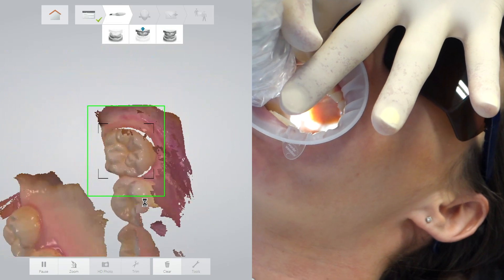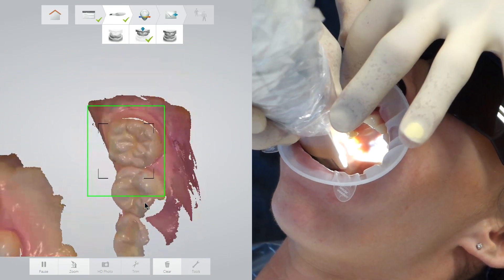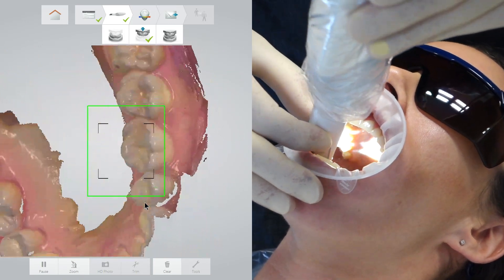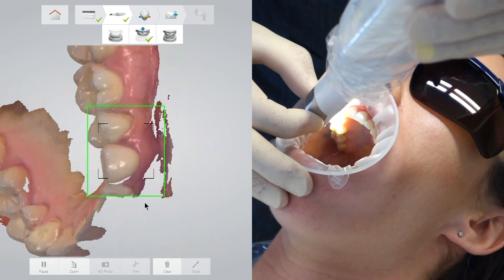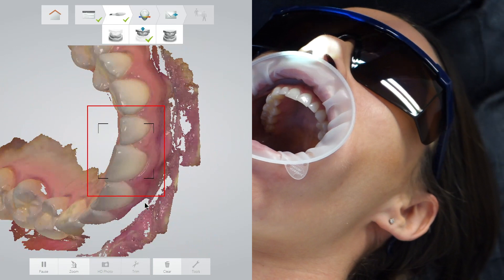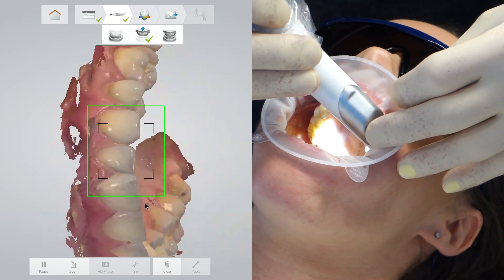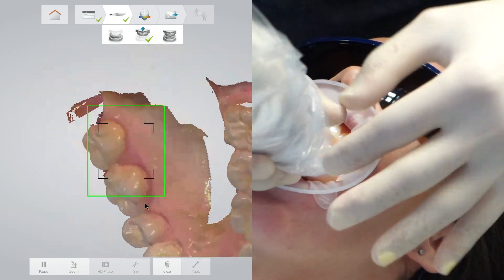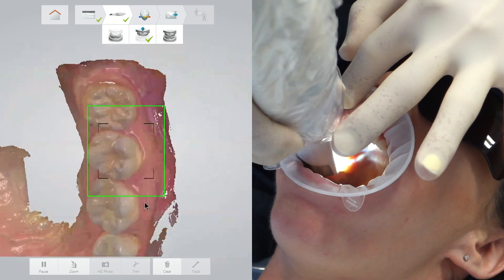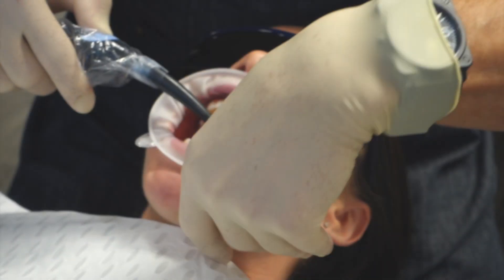I am gently rocking and gently moving. Unfortunately I hit the on/off button, which is really not very well placed. I'm still moving, looking at the computer screen rather than the teeth to see what images I have scanned and what areas I need to add. You can see that I'm using my other hand to hold the tip of the scanner. When I move the scanner to a totally new area, if I have created a good foundation then the program recognises quickly where it is and can add new images quite efficiently. The upper scan is now completed and we confirm its quality by carefully looking at the computer screen.